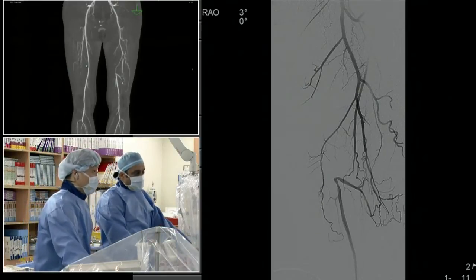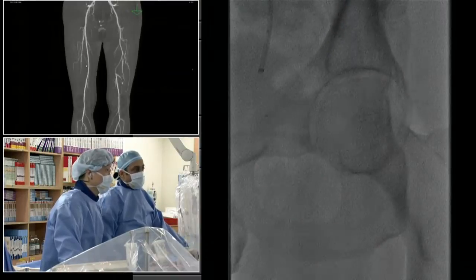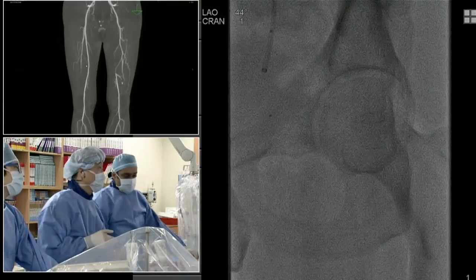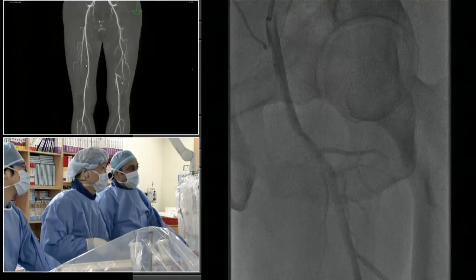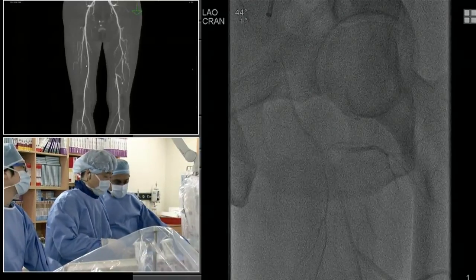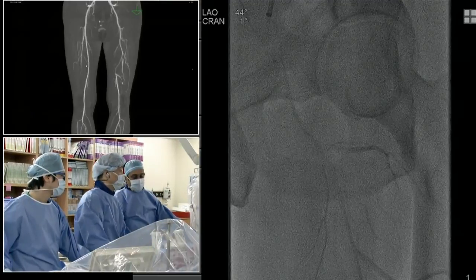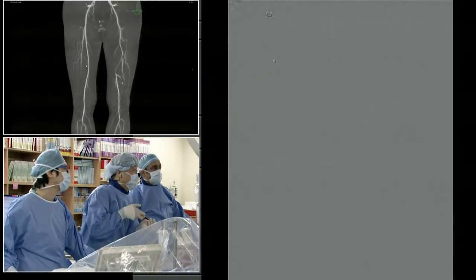As I get started, if anybody on the panel or moderators have any specific thing that they would rather use with this? So there's all sorts of different devices you can use. I use the Wildcat sometimes in cases like this. There are a bunch of devices out there. There's the Bridgepoint device, the Pioneer device.